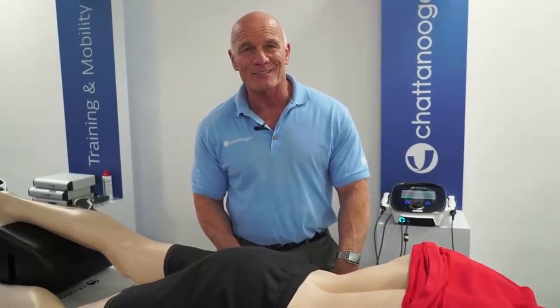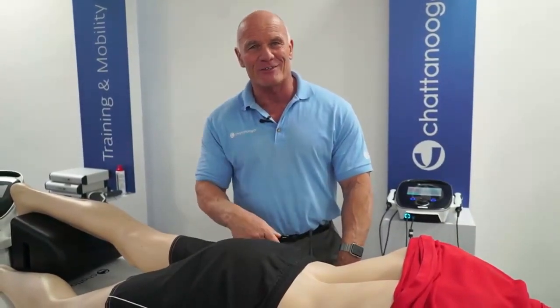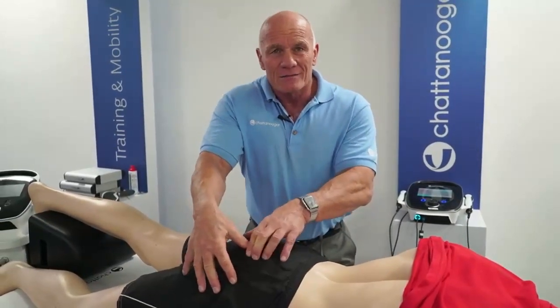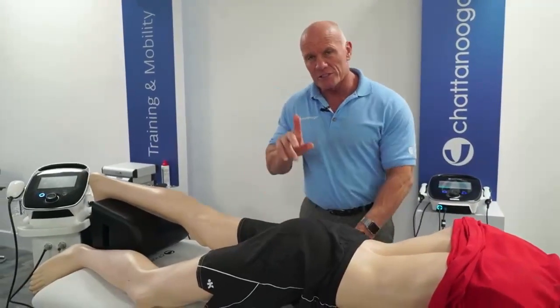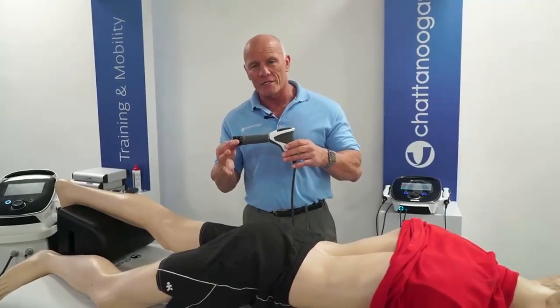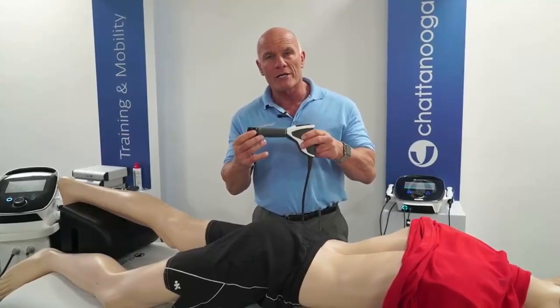He's got fantastic development of those glutes, very firm. So I'm trying to palpate through here, and I'm not finding that trigger point. So I want to share with you a way that you can use your radial pressure wave to find deep-seated myofascial trigger points that you might not be able to find on palpation.